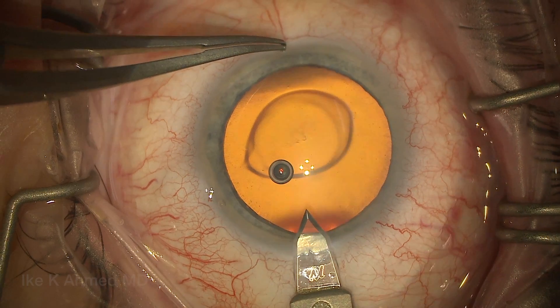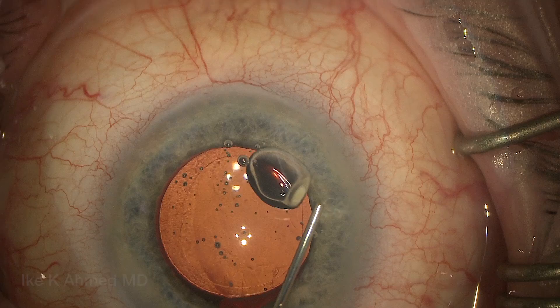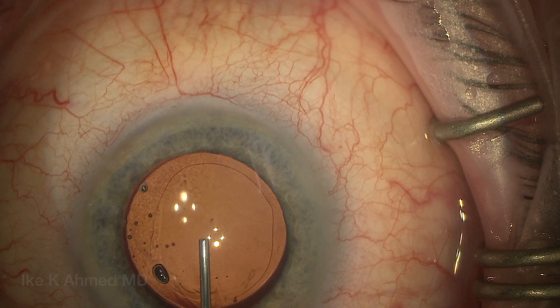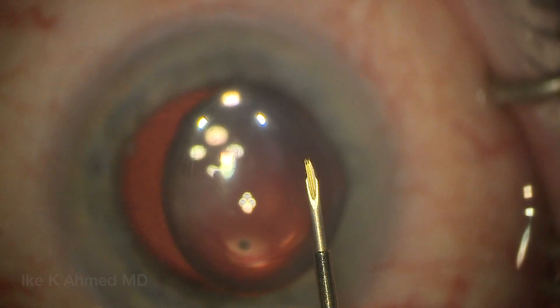The main incision is made temporal in all cases, and this will be used both for the FACO as well as for the ZEN implantation. Once the cataract and lens implantation has been performed, we'll leave the OVD in the eye while injecting some Helon GV. I find that keeps the anterior chamber well formed.